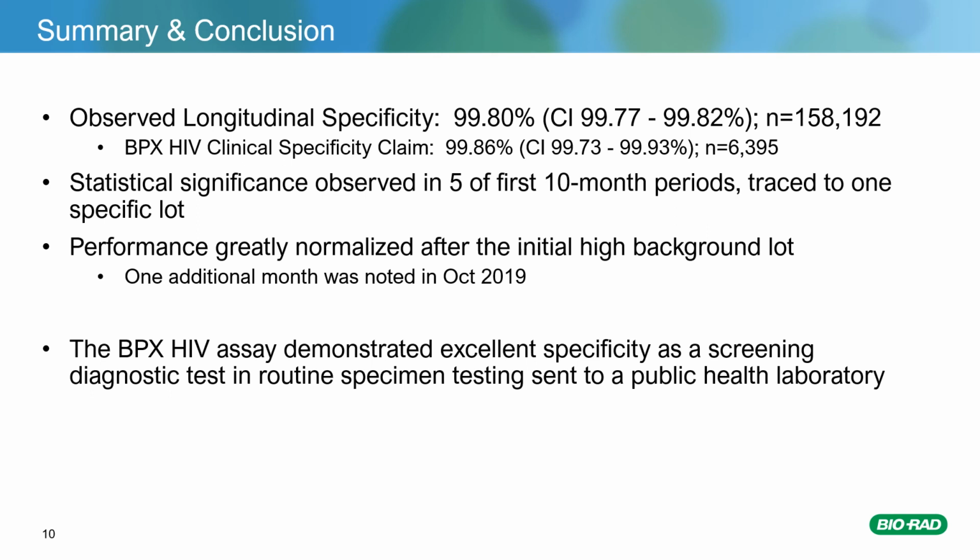In conclusion, the BioPlex HIV assay has demonstrated excellent specificity as a screening diagnostic test in routine specimen testing sent to a U.S. public health laboratory.